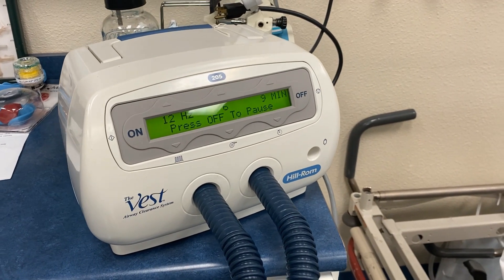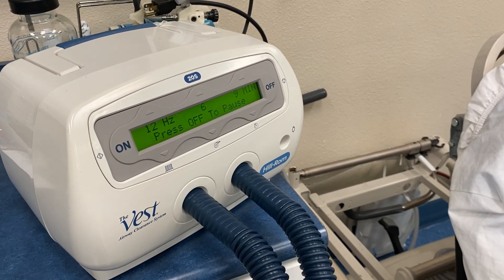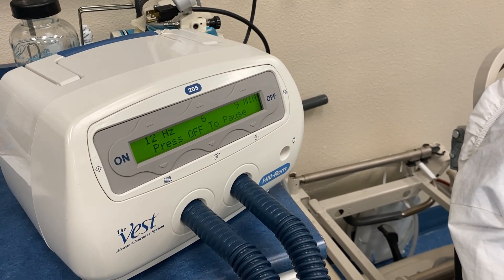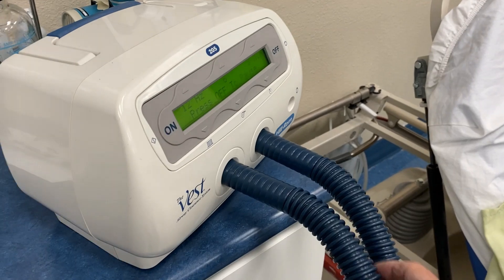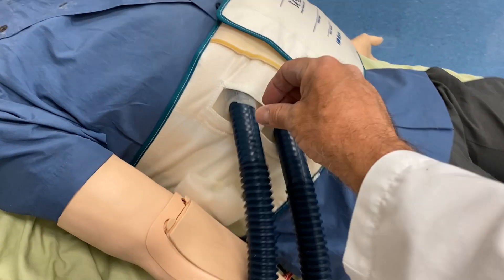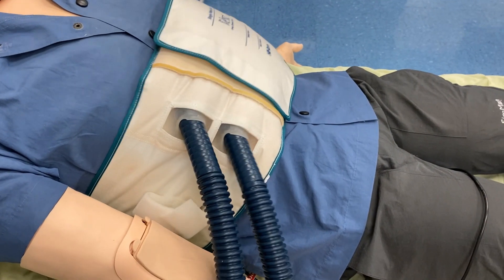There is the vest running at 12 hertz, an intensity of six, and the time is about nine minutes remaining. You can also note that it says 'press off to pause the therapy,' so we can pause if the patient needs to talk to the doctor and then resume. Now let's take a look at these simple connections — these tubes are the same at both ends. They just slip into the connectors here, and on the vest side there's a silicone adapter that each tube inserts into. The silicone is tight so it holds those connectors in place without any difficulty.